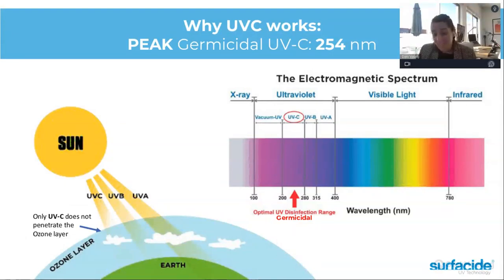As long as it's not in a shadowed area, it's not like our light becomes stronger over time. Once a pathogen is exposed to it, it is deactivating it. Now it just needs to get the correct dose. So the bigger the space, the longer you want to let it run.